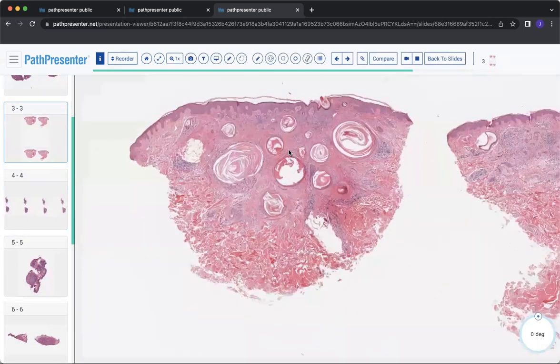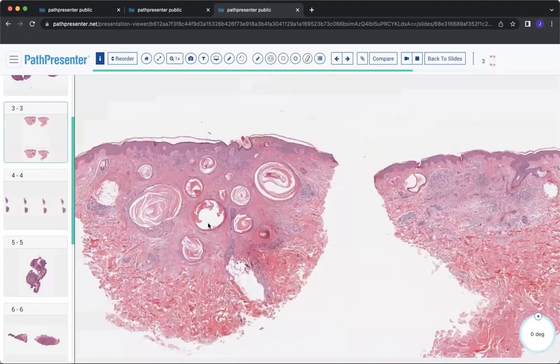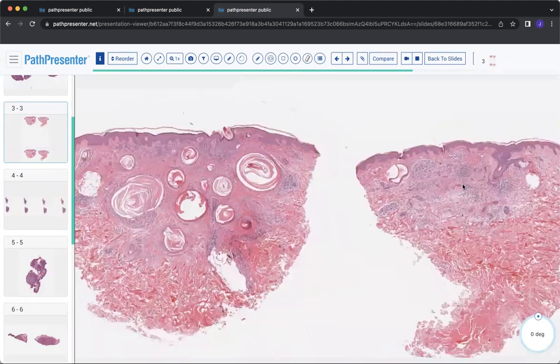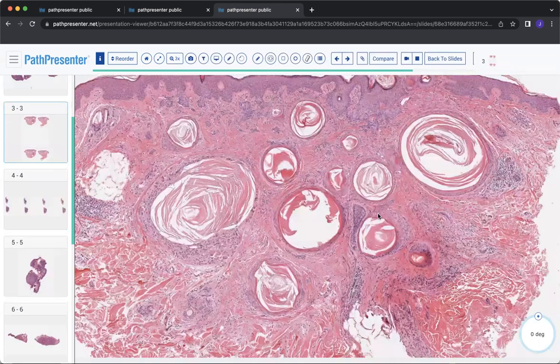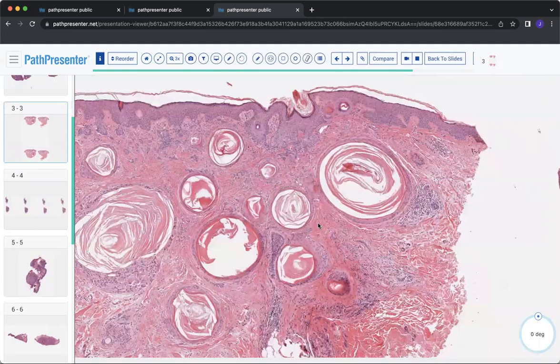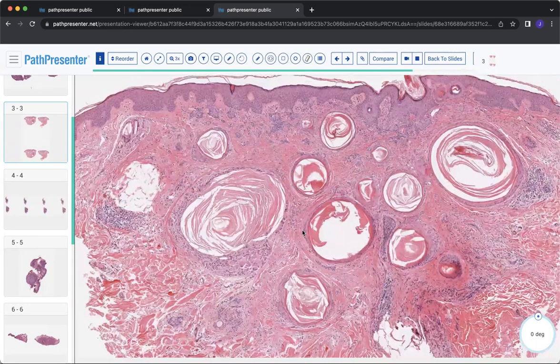Moving on. So here we have a punch biopsy, and you can see what jumps out to you. These milia-like cysts are essentially staring you right back in the face. So these have been likened to an owl eye pattern. In dermatopathology, or in pathology in general, it's been tradition to imagine various shapes and create images of what you think they might represent. So somebody thought this could look like some type of an owl's eye appearance, but it's just very well demarcated keratin-like cysts.